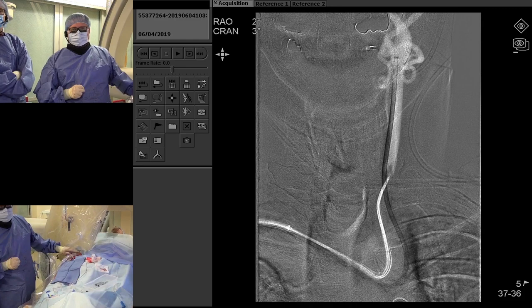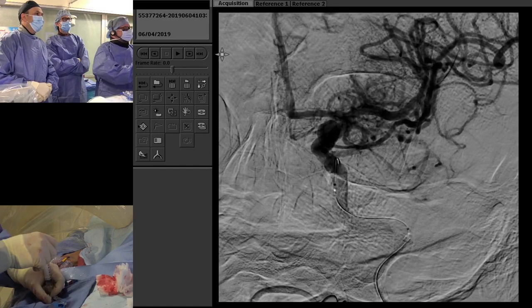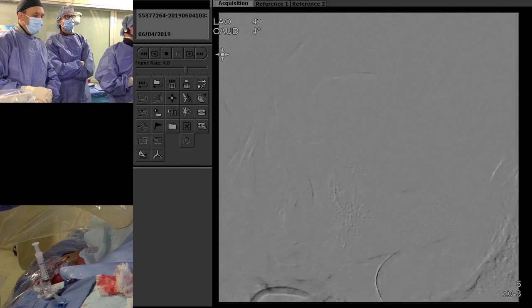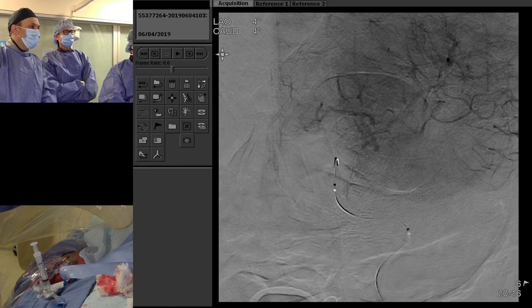We're just getting some working projections now for the aneurysm. We want to see the distal landing zone of the stent — the area of the artery beyond where the aneurysm is where you're going to place it — and the proximal landing zone, and a decent idea about the aneurysm neck.